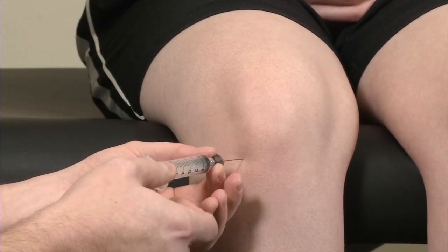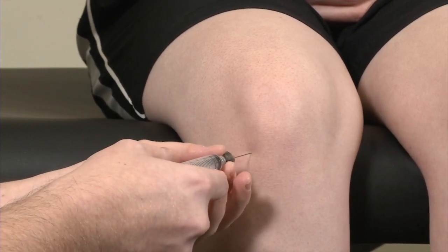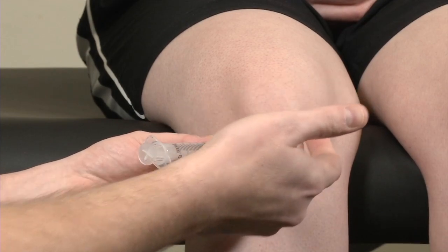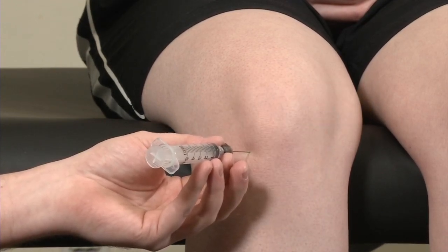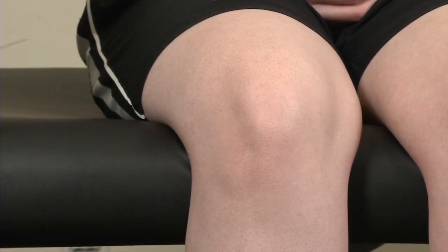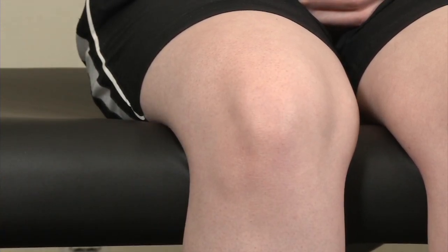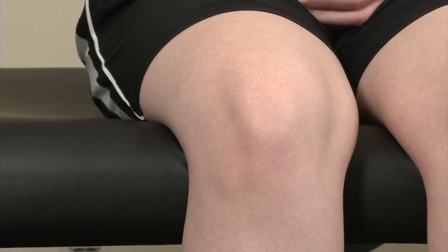You can essentially hub the needle at this point, but you want to make sure that you aspirate to ensure that you're not into some artery. And then you can go ahead and plunge the needle to inject your injectate at that point. You can go ahead and withdraw the needle, clean the skin, and apply a sterile bandage. And that covers the inferior lateral approach to knee injections.